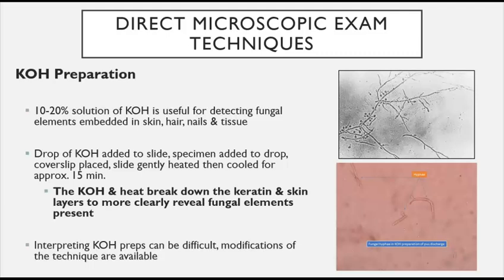The KOH and heat break down the keratin in the skin layers to more clearly reveal fungal elements that are present. Interpreting KOH preps can be difficult, so there are modifications to this technique that are available.